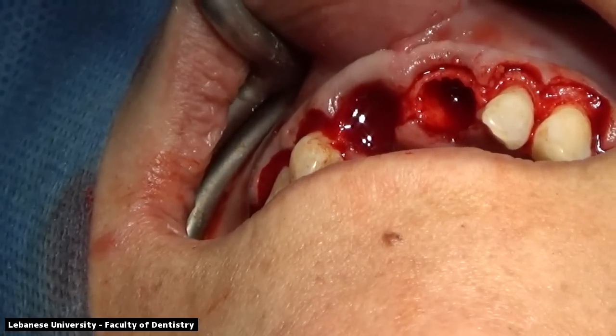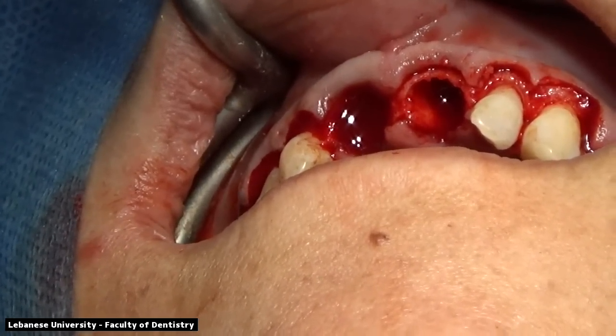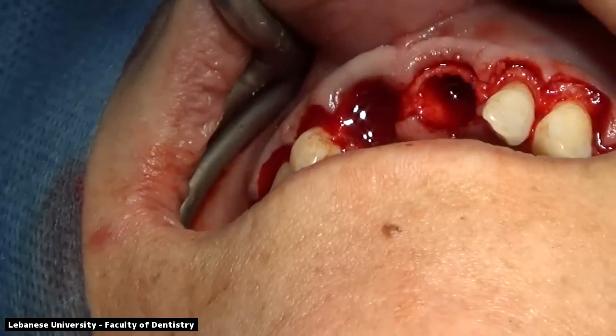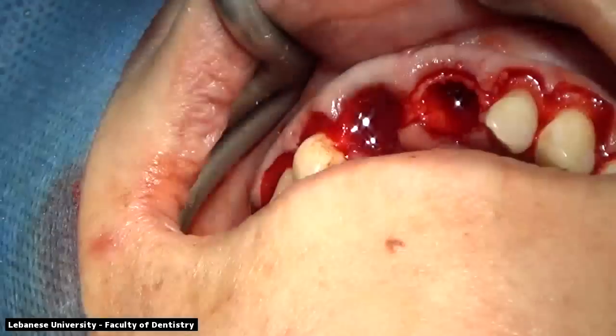Dr. Susanna, if you can show us the remaining roots, just use a plier and remove one of the remaining roots and just show it on the camera, please.